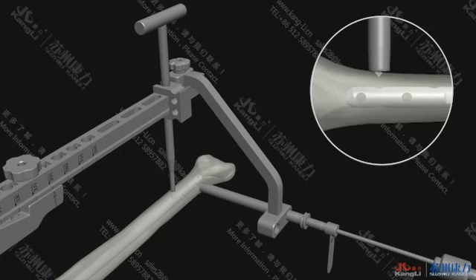When a small pit shows up on the bone cortex, drill with the 4.0 drill bit. When the first layer of bone cortex is drilled through and the 4.0 drill bit reaches the inner wall of the contralateral medullary cavity, adjust the distance between the ball spike on the 4.0 drill bit and the 4.0 inner sleeve to about 0.8 cm using an SL wrench to protect the soft tissue of the contralateral skin. Then continue drilling until the contralateral bone cortex is drilled through.